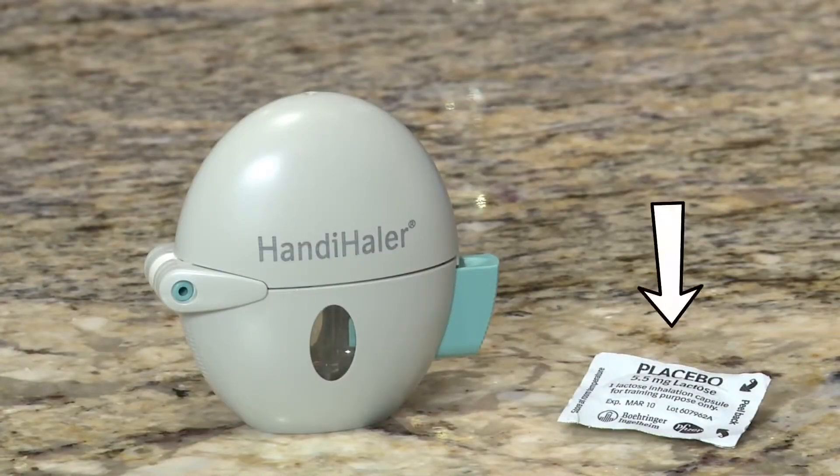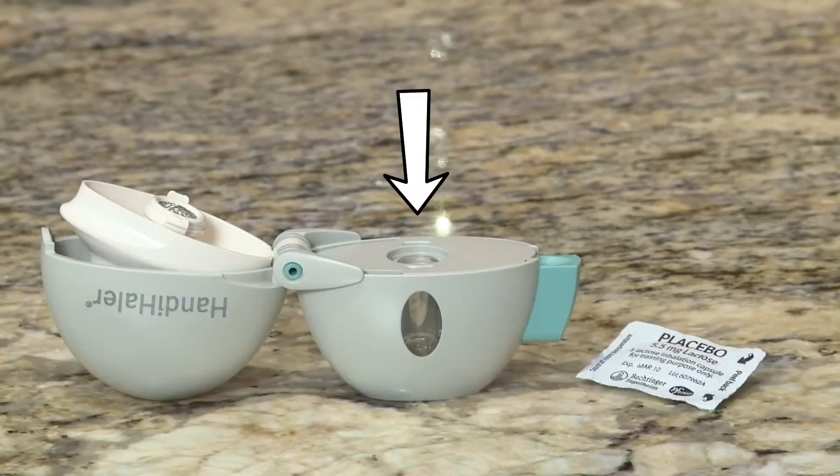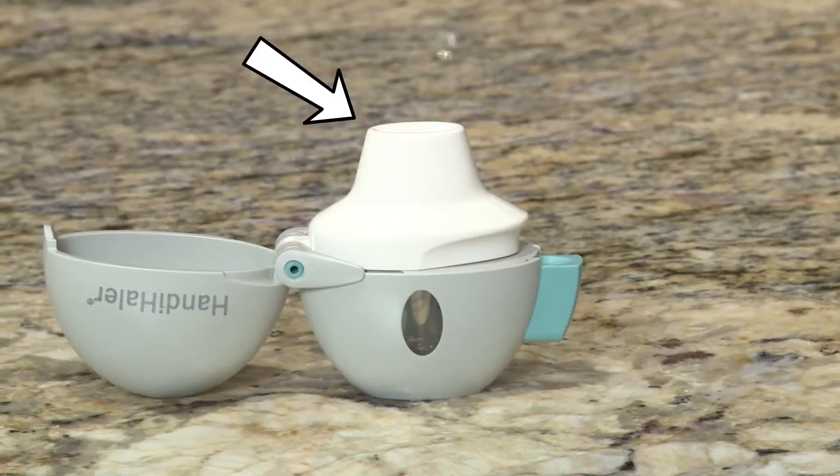The Handihaler lets you take dry powder medicine in capsule form. It comes in a blister pack. When it is closed, the lid keeps the mouthpiece clean. The capsule chamber holds the medicine. The piercing button opens the capsule and releases the medicine. You hold the Handihaler by the base. The mouthpiece is where you breathe in your medicine.